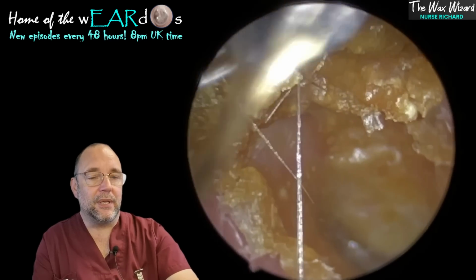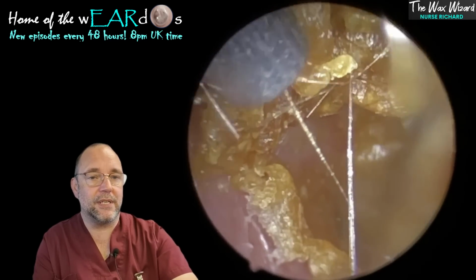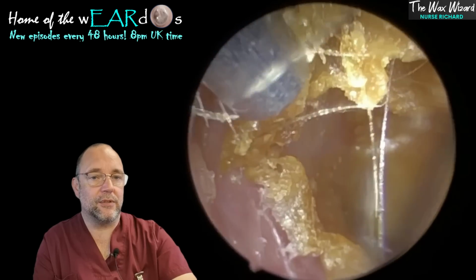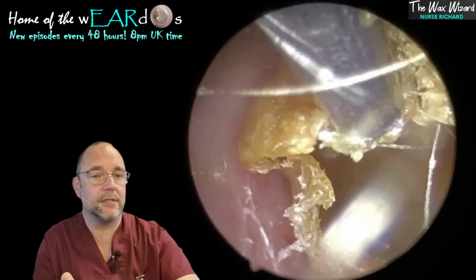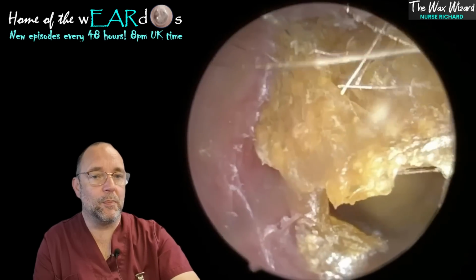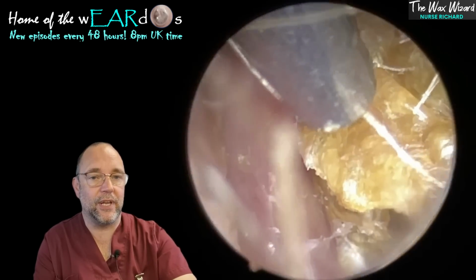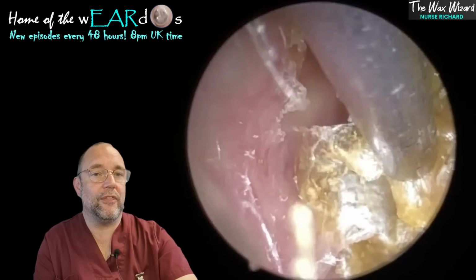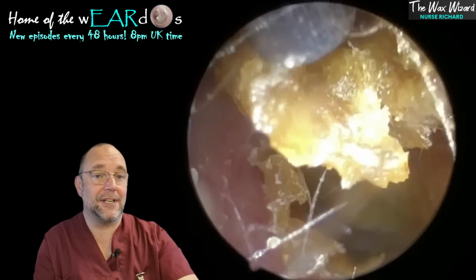Because this is the frustrating thing about this one. Whilst it is these very thick layers of dead skin, it's very dry and quite brittle as well, so it doesn't tend to stay in one piece. The last bit did at the end, like I said, so stay tuned for that. But before you get to that point, you have these thick layers here that come away like cornflakes. Sorry if anyone's just having breakfast or just had it or thinking about having cornflakes. But it's exactly what it looks like.